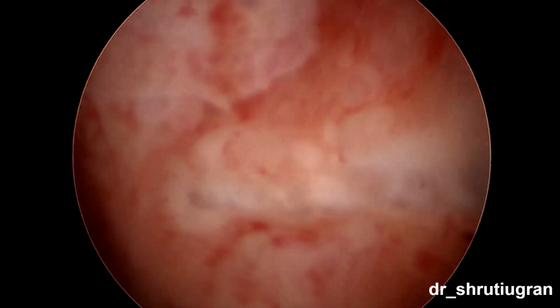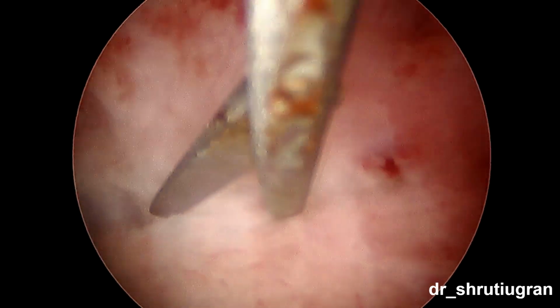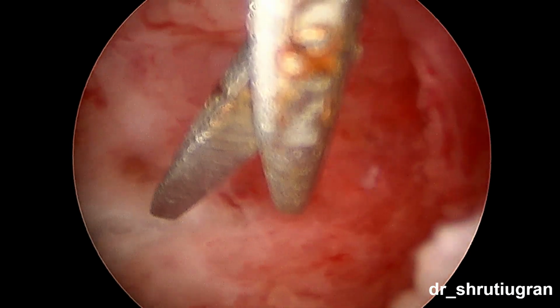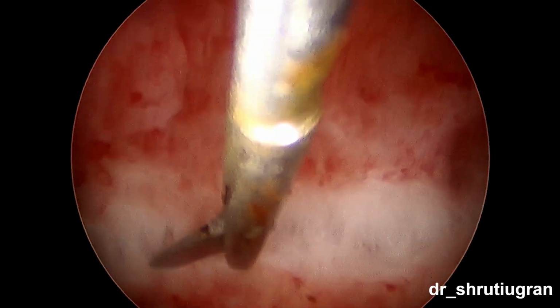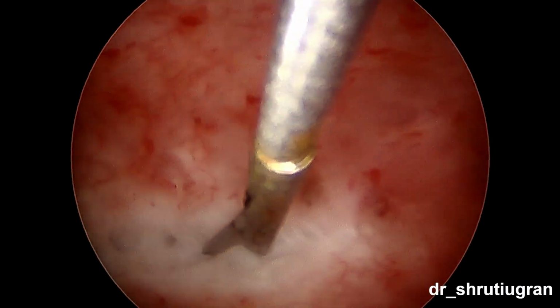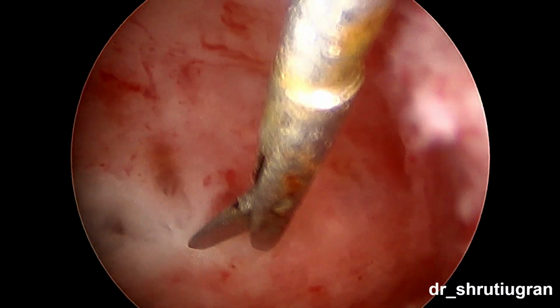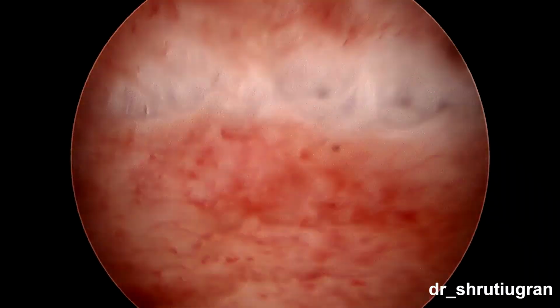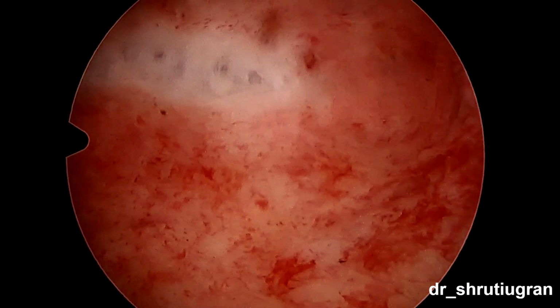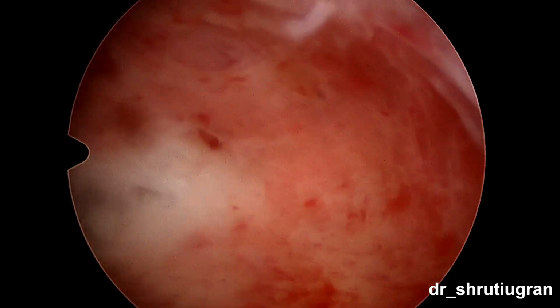So the features that were described in this hysteroscopy are highly suggestive of adenomyosis, and this could be one of the reasons for recurrent IVF failures in this lady. We went ahead and completed the endometrial scratching at this point. And that was the final picture. Thank you.